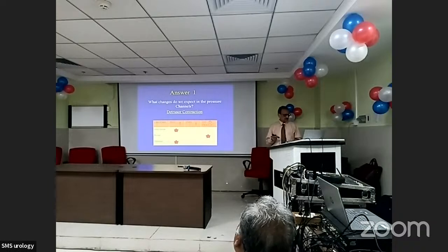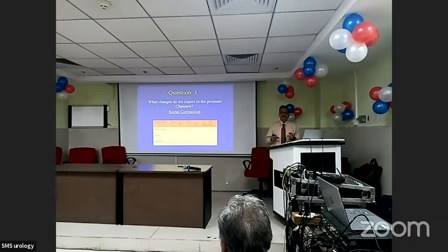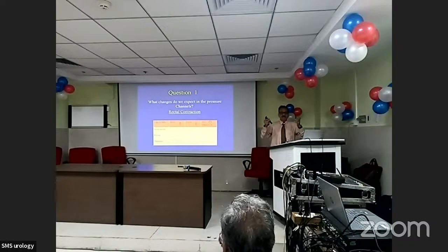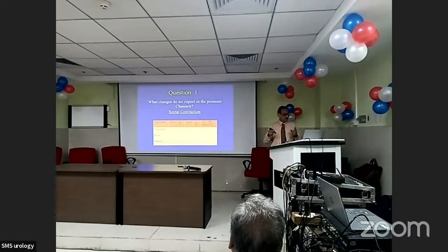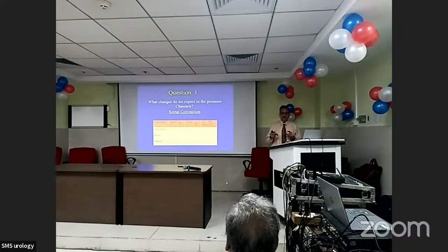Now, take just one other situation: rectal contraction. Very commonly seen in neurogenic bladder dysfunction, meningomyelocele patients, various kinds of spinal cord injuries. Now, what changes do you expect in the pressure channels? Intravesical pressure? What happens? Who says rise? Please raise your hands. Rectal contraction. Come on, raise your hand. Okay, fine. Rectal? Rise. Detrusor pressure? No change.